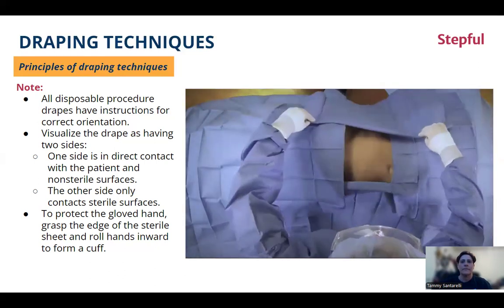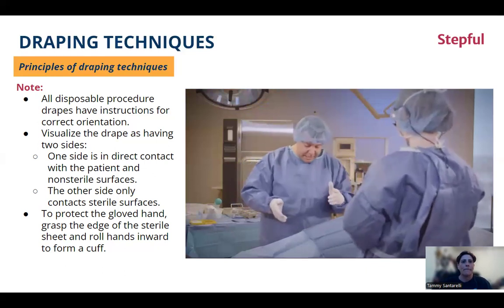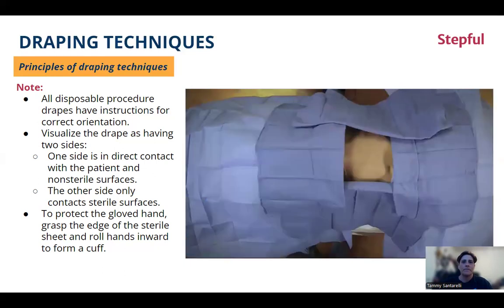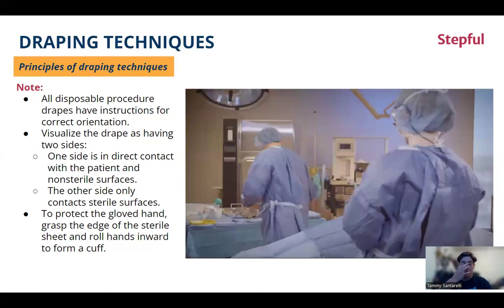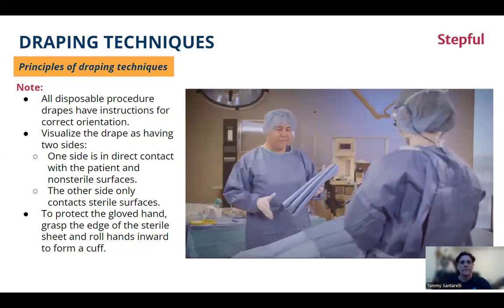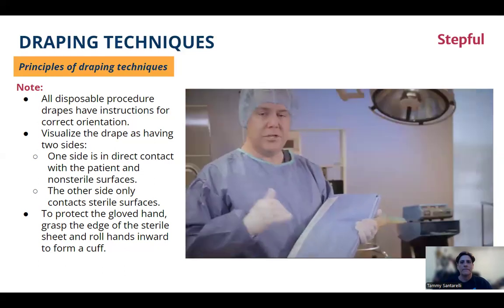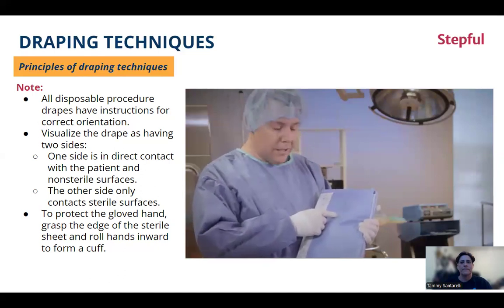Now, I always made sure that I was at least 12 to 18 inches away from the field. Even though I'm protected by a drape, I still don't want to risk contamination. So we have a pretty good squaring off right there. Our last drape is the laparotomy drape. Now, the great thing about drape manufacturers is they tell us exactly how to put this drape on the patient. So we can see our little man here telling us which way it goes.